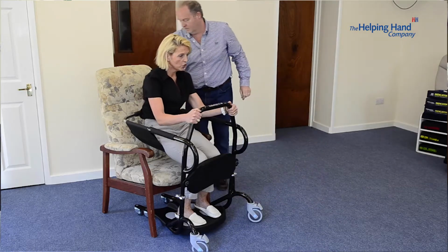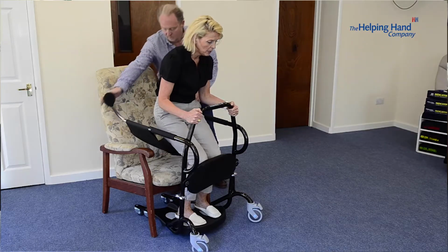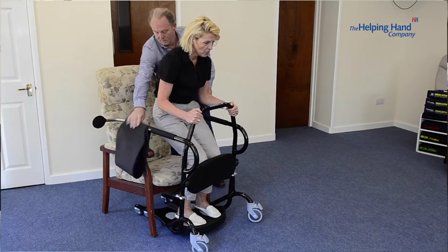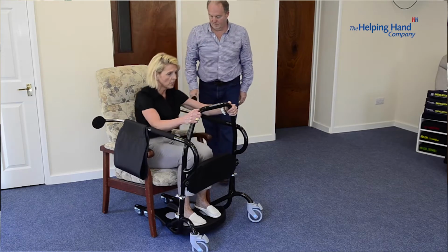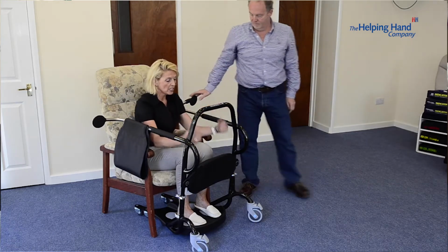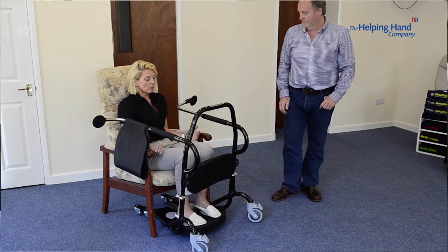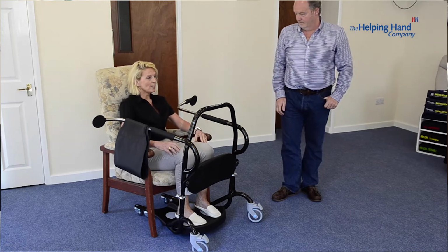Transition back out, gently coming up, removing the back paddles, flicking the seat over, and then sitting right back down. Because it's nice and narrow, I can get my bottom right to the back. I don't have to reposition. I'm now sitting back in the chair.